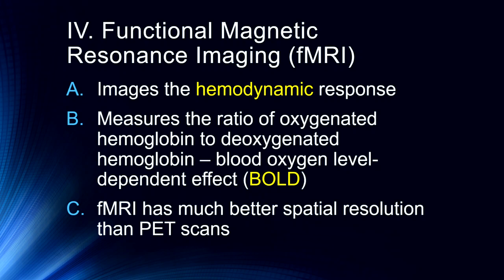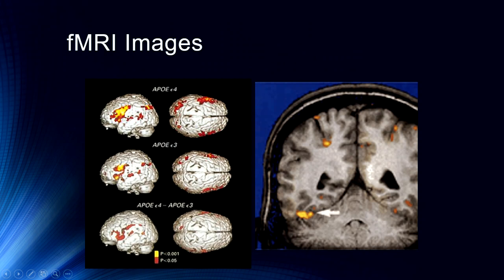There is pretty rapid progress in this field, and there's actually a company that has developed a bedside MRI unit, so you can actually do a structural brain scan right there at the bedside. It just plugs into a regular old outlet, which is pretty miraculous. So eventually I think we'll get to the point where we'll have this with fMRI as well.